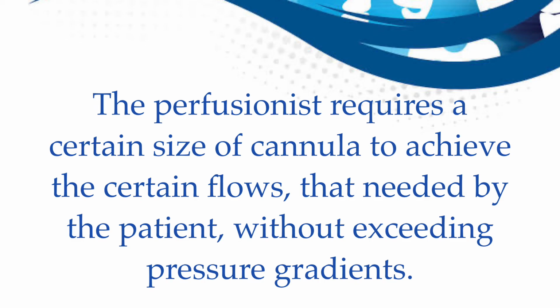The perfusionist requires a certain size of cannula to achieve the flows needed by the patient without exceeding pressure gradients.